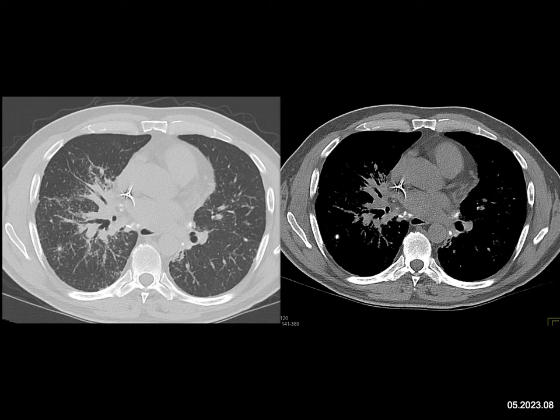TB you can consider with any inflammatory process, can give you nodes. Lymphoma, you can have bulky nodes and lymphangitic spread. This, in fact, could be lymphangitic spread, while at least I'll think about lung cancer as well. At the end of the day, this was a young patient. Patient was scoped. This was sarcoidosis.